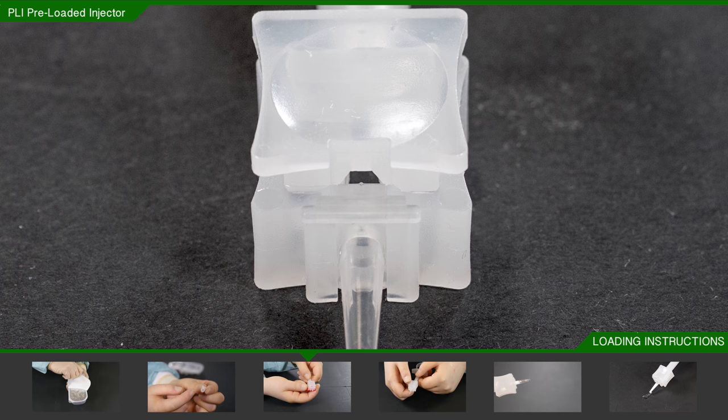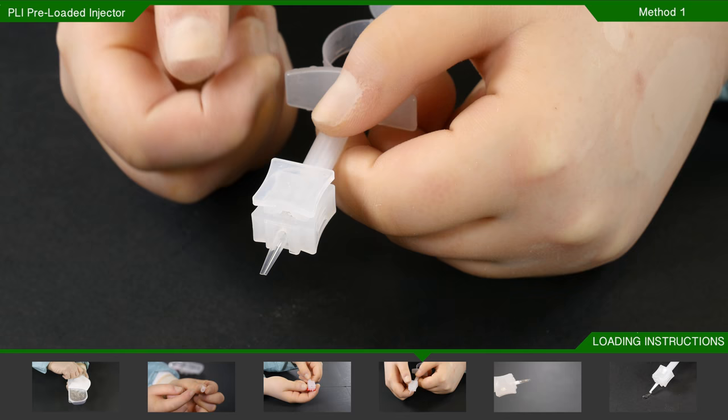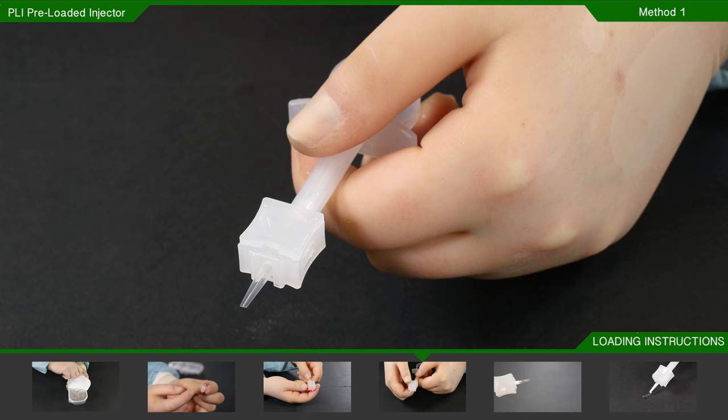Holding the tip away from you, place your index fingers under the body with both of your thumbs on the loading tab. At this point, press firmly so that the tab is fully flush against the PLI body.